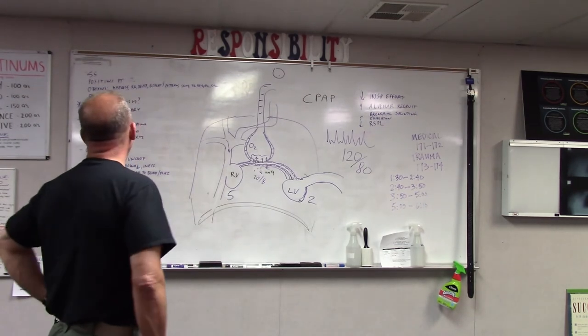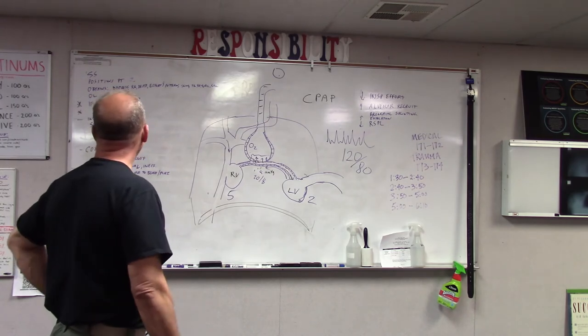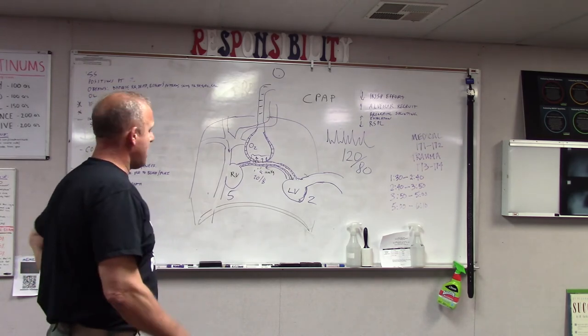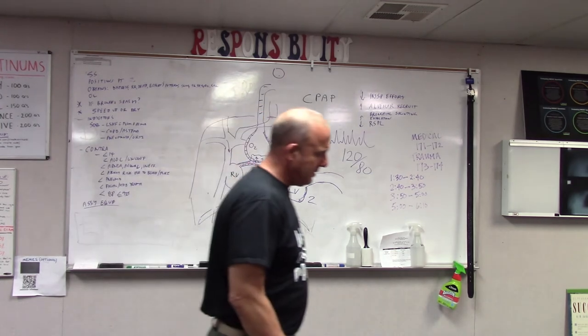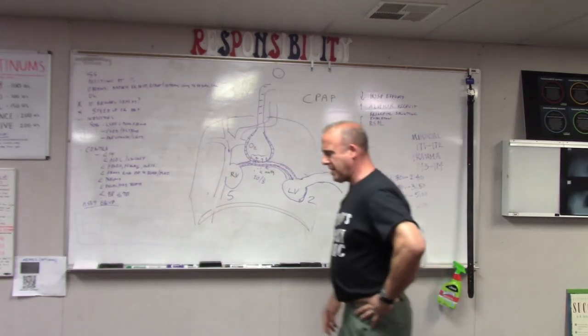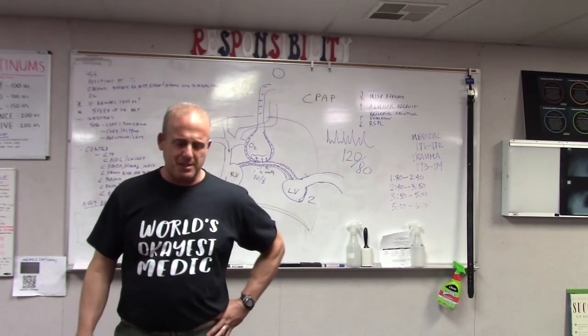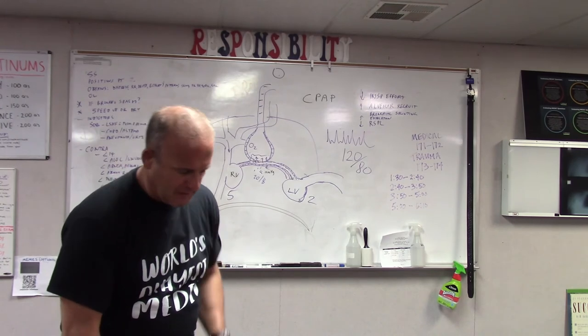Pulse rate, blood pressure, SpO2, CO2. Obviously, with a decreased SpO2, give them increased oxygen. If it's bronchospasm, bronchodilate. Now there's again a kind of reflexive spastic attitude out there that albuterol bronchodilators are wrong for pulmonary edema. Well, that's a bunch of crap, sort of.